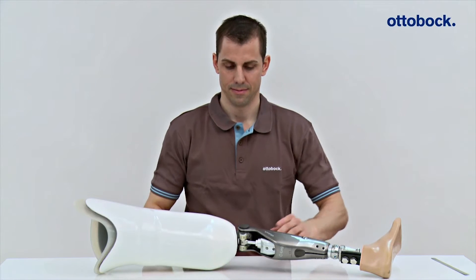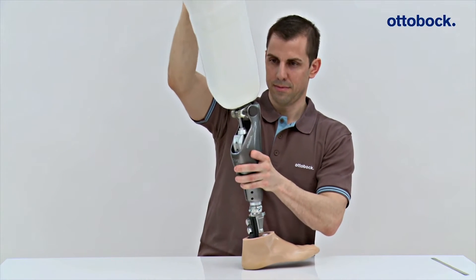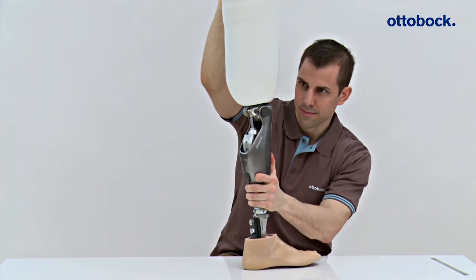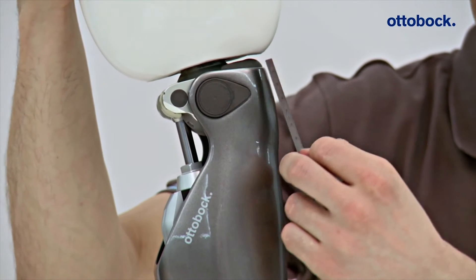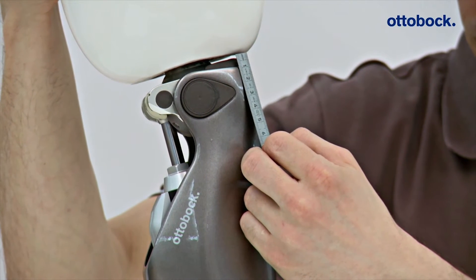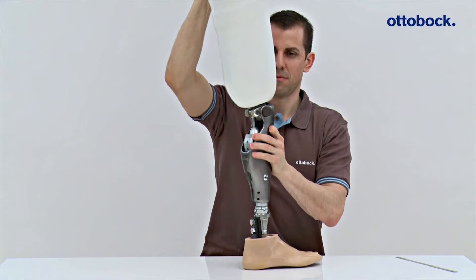Following bench alignment of the prosthesis, it is necessary to check that there is no potential for contact between the socket and main electronics at maximum extension of the knee joint. Even if there is still space when the knee is extended, collision and therefore damage to the main electronics may still result when weight is placed on the prosthesis.